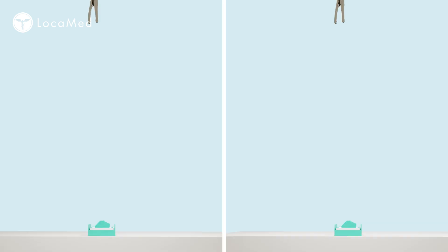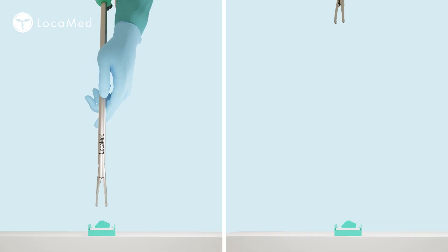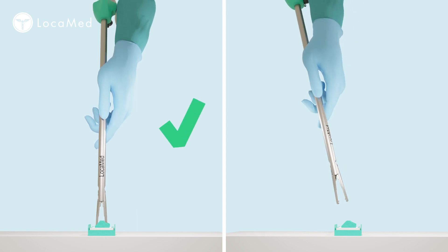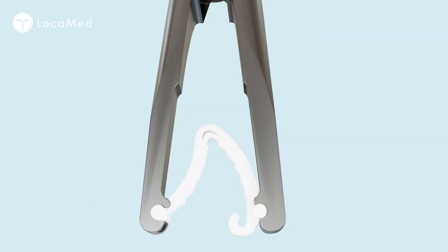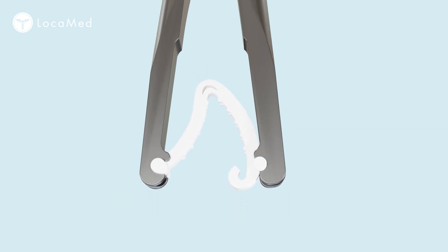Hold the applier by the shaft vertically above the clip to be loaded and push the jaws gently down over the clip until you hear a click. Check that the bosses are sitting in the notches of the applier jaws.